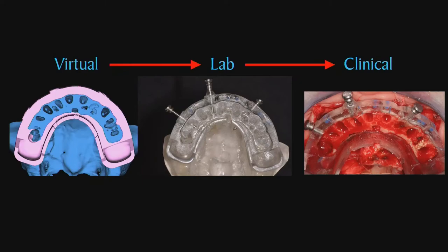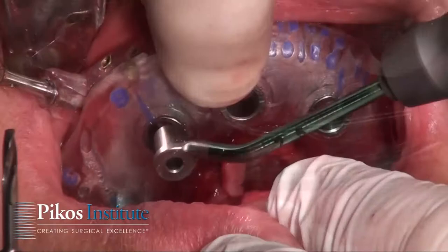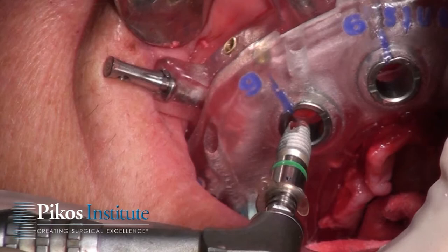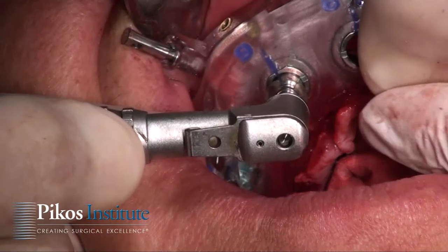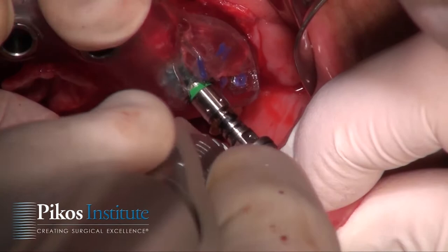This is a different, better, and more efficient approach. The surgical guide is now pin-indexed into the foundation guide, and we use appropriate keys for whichever implant system we're working with to fully guide implant placement. The predetermined length, diameter, and angulation of the implants are all planned in advance through virtual planning — the entire workup is virtual. Here you can see implants being placed in a very specific manner: five implants in the maxillary arch in this particular case.